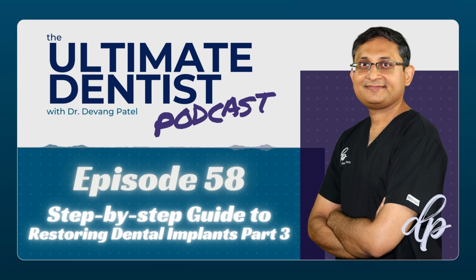Now you can't use this technique, because if the technician drills a hole from the buccal of the crown to get to the screw, it won't look aesthetic because you need to fill it with composite. The composite will never match the porcelain. Now we have a technique where we do angle correction. Again, I will discuss this in the number 6 podcast. But in general, with a screw mentable crown, this is how the technician does that.